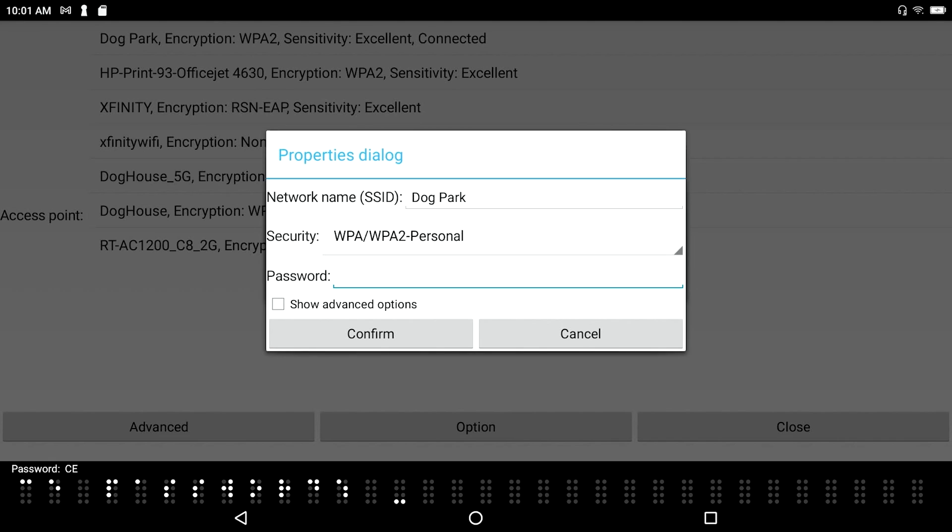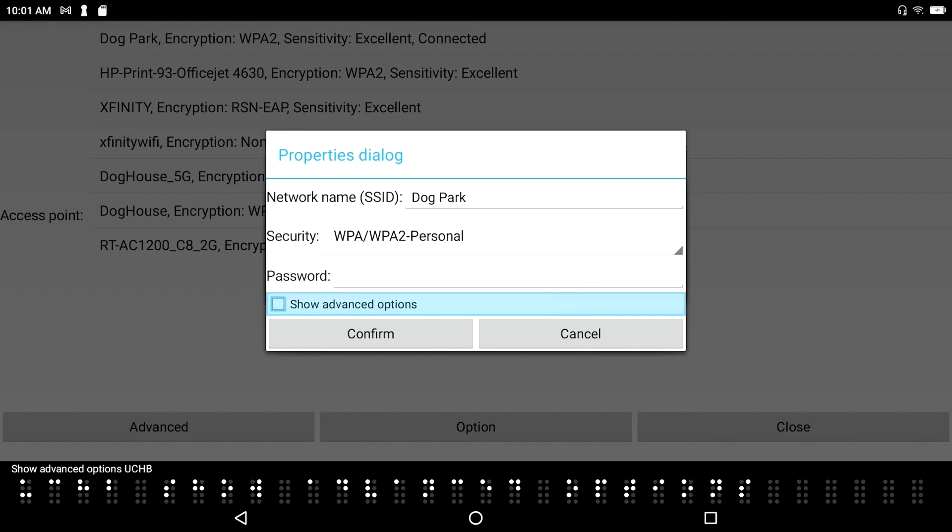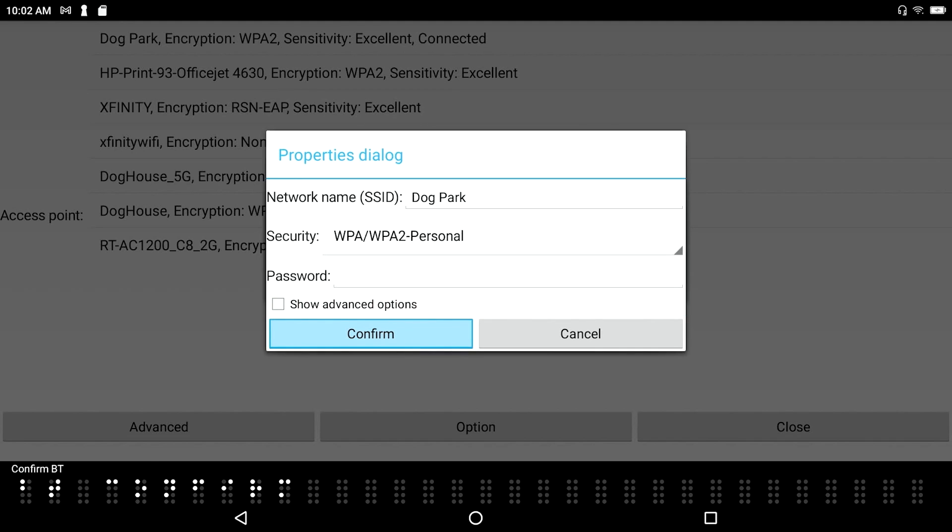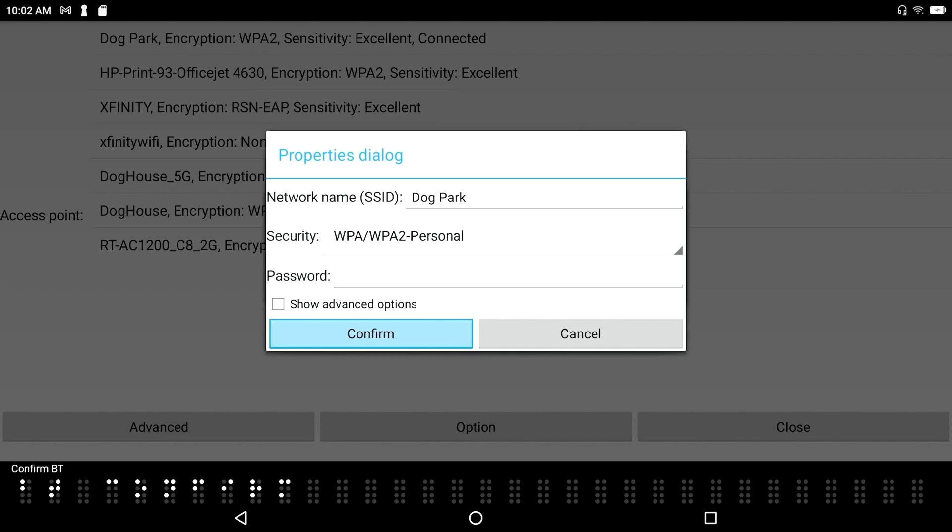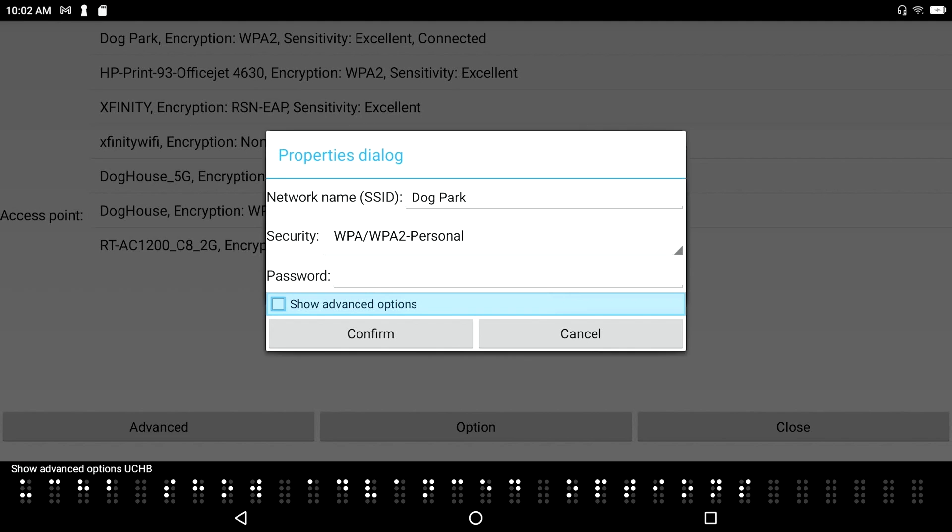Password. Computer edit box. Password option. Show advanced options. Checkbox unchecked. And by the way, if you've got a sighted network administrator, they can connect a USB-C monitor. It could be via a USB-C hub. Or, in which case, you can also connect just an HDMI monitor or a smart TV. And they can also plug in a USB keyboard to control everything. Of course, we do have support for wireless keyboards as well. Confirm button. Show advanced options. Checkbox unchecked. Let's go ahead, and I tabbed. Confirm button. Let's shift tab, space F3. Show advanced options. Checkbox unchecked. And check this checkbox that says show advanced options.